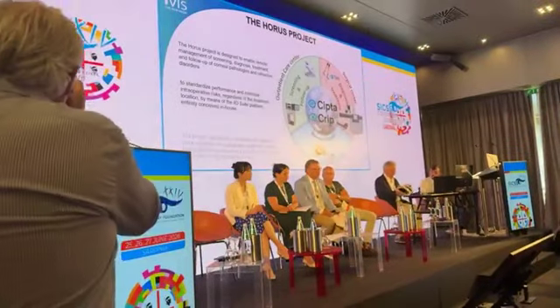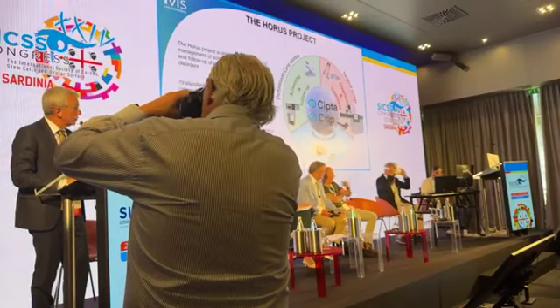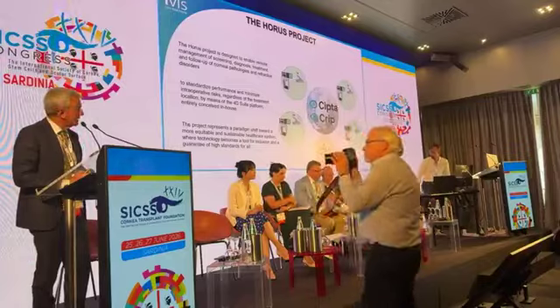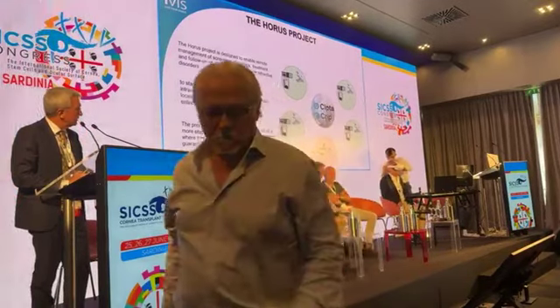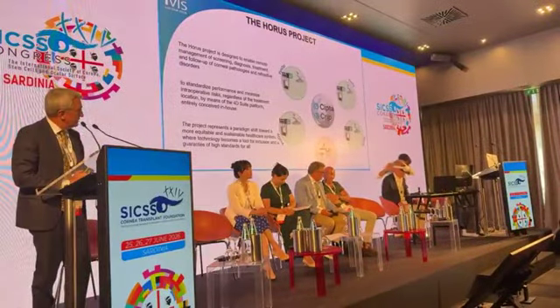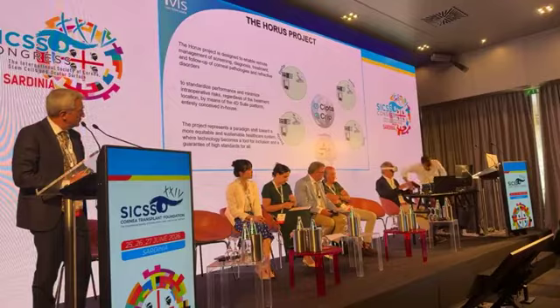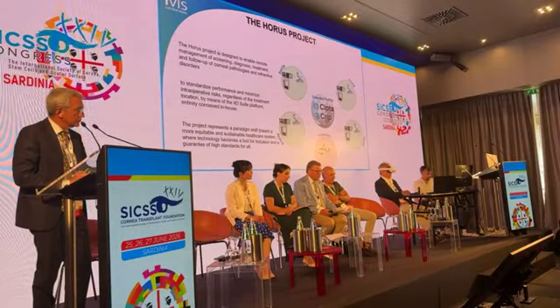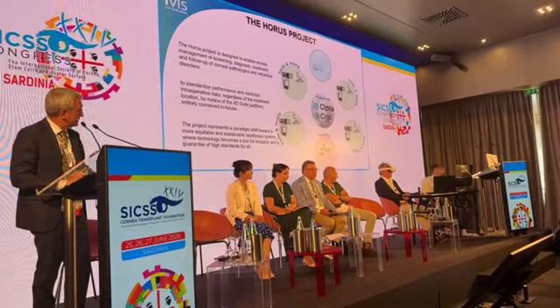First of all, it's a full, complete system where the software controls all of the steps. You may have several screening centers where the patient delivers the pre-op to the web. The ablation plan is planned on the web and delivered to the laser. The laser will execute the treatment and generate the ablation. The ablation allows us to define the expected post-op, and when the patient comes for the control, we will check if the treatment is exactly as expected.